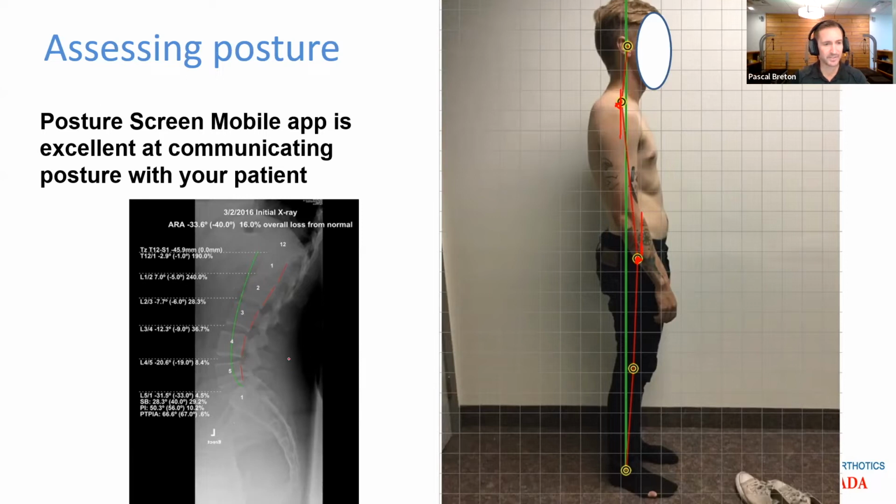On X-ray, there's a very simple way to measure it. I just come to my T12 and find the posterior inferior corner of it, and I would draw a vertical line straight down. And then I use the posterior inferior aspect of S1, and I draw a line straight up. So this X-ray is this young man's X-ray, okay? So this posture equates to this X-ray. On X-ray, yes, we can clearly see that T12 sits behind S1, so we have that posterior translation, or I can measure it on posture by looking at the AC joint relative to the pelvis. So that would be my third indicator.